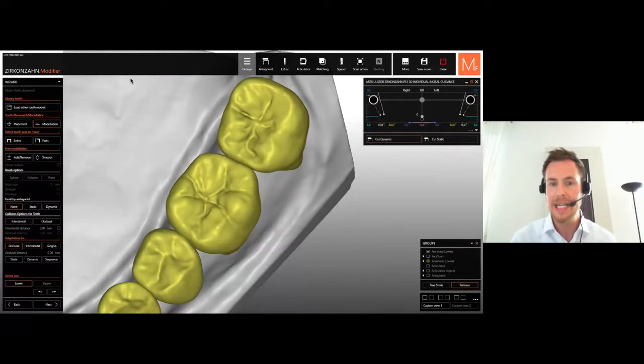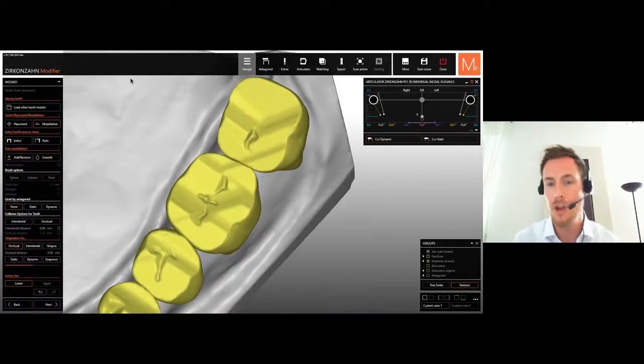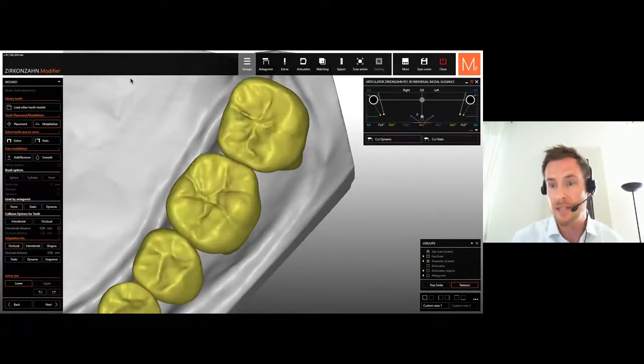What we need is a dynamic movement, by using the 3D articulator, for example. But I have to know how to program the articulator in protrusion and lateral protrusion movements. When I'm not doing that, I get this kind of straight cutting. But when I know how to program the articulator, then I have a better, dynamic cutting surface.